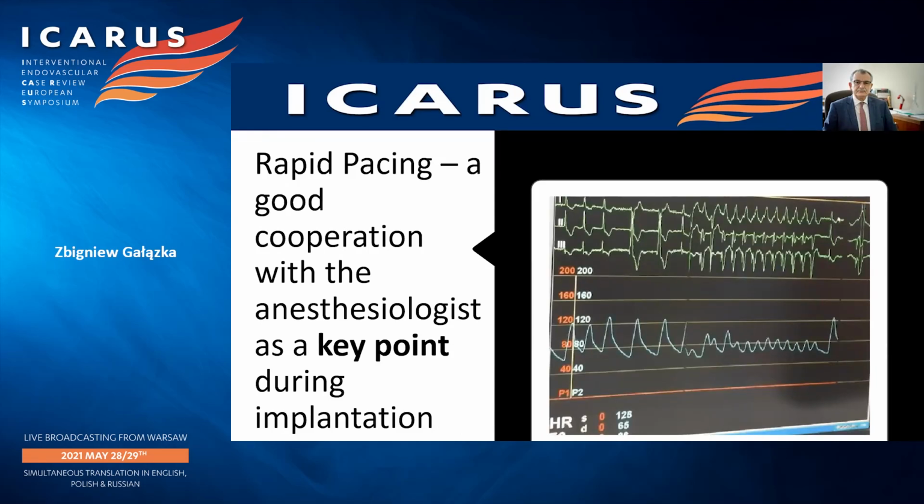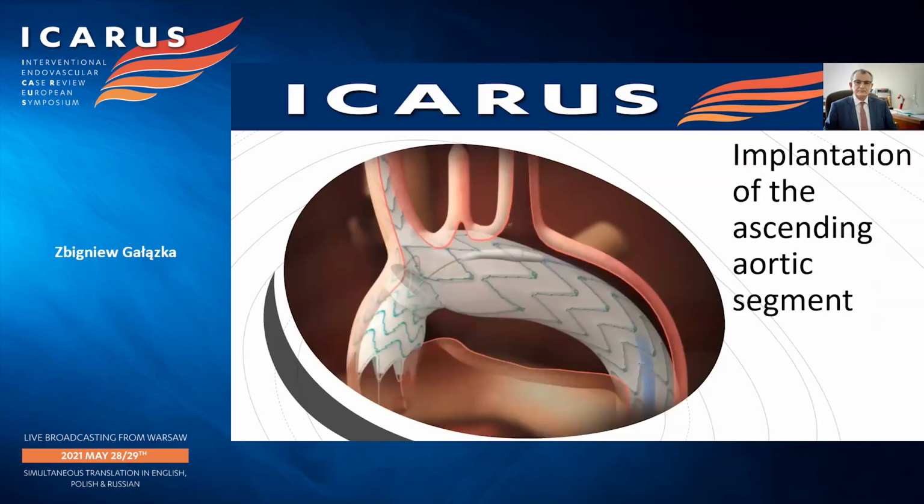This time we used rapid pacing. It's very important to have good cooperation with the anesthesiologist; in our opinion, this is a key point during implantation of the stent graft in the aortic arch. The next step is implantation of the ascending aorta segment.